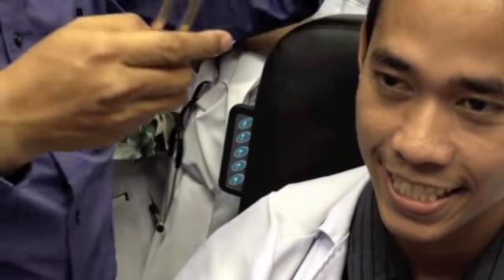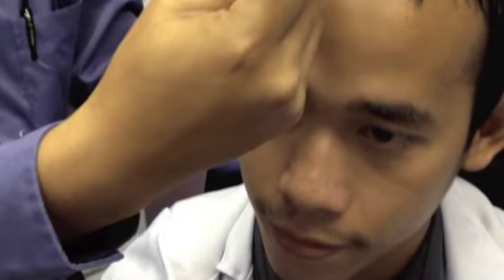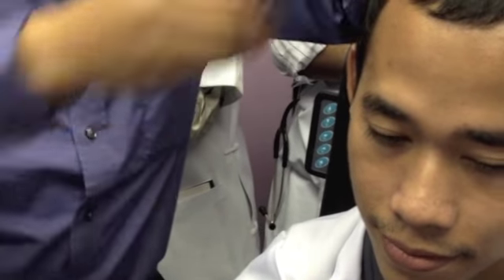Occipital. Ada turban. But avoid the turban. Okay, it's a bone conduction test. So where is the bone on the head? Everywhere, right? So you can put anywhere you want. Not only midline. Bukan midline sahaja. But if you put this side, patient tends to hear from this side. Bias. So that's why you put midline. Understand? Remember the Sikh: jerawat, janggut, this side. No midline. But ideally you put midline lah.